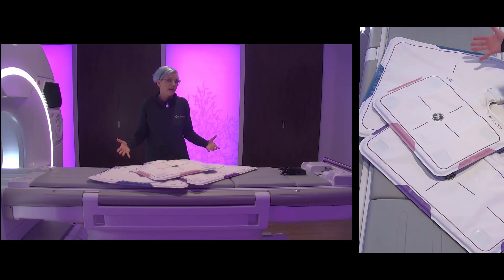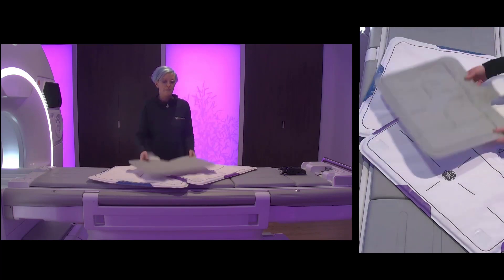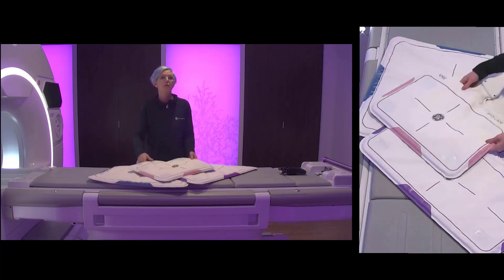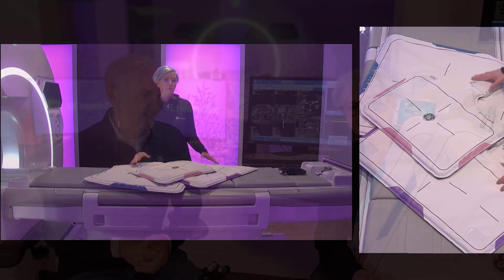The last advantage is thinking about disinfecting these coils. Since it's a clean and easy surface, it's easy to just wipe them over with a chloro wipe after the exam and you are ready for the next patient. So overall, it's really a beneficial tool to have to optimize the workflow.